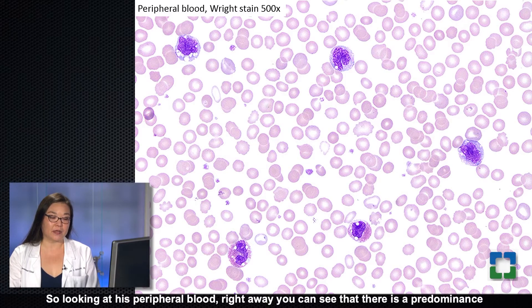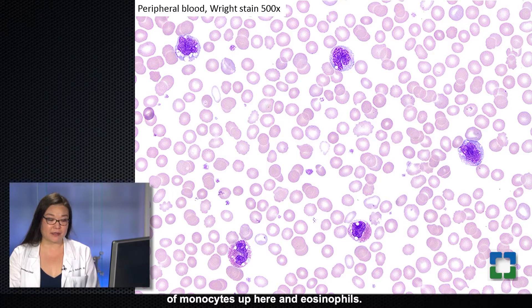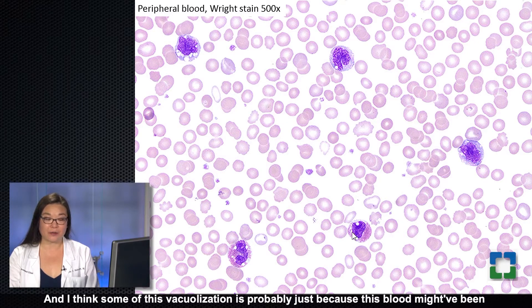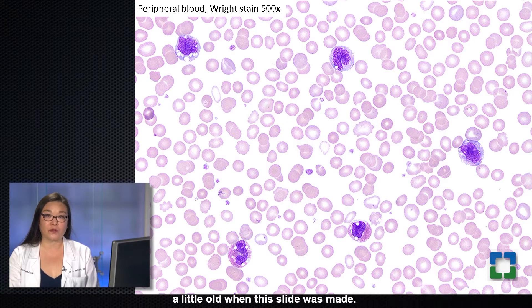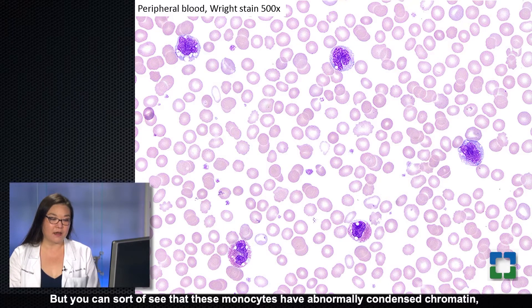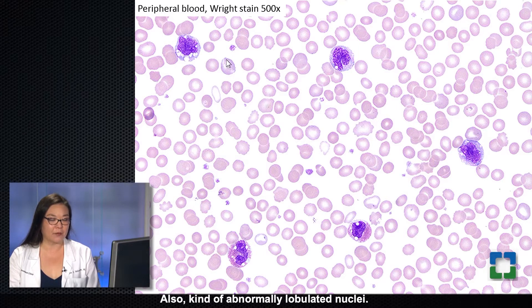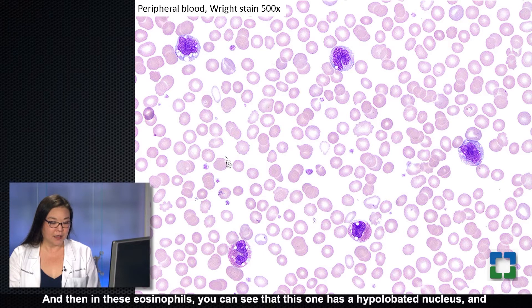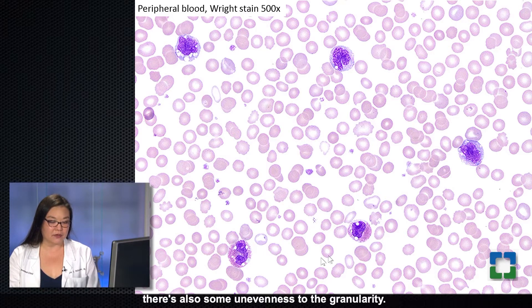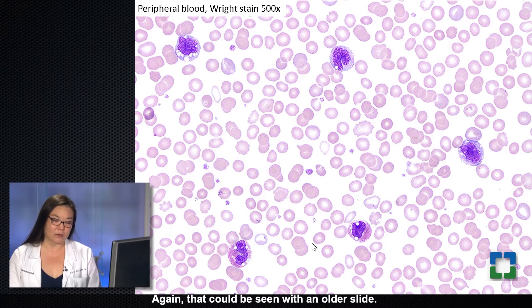Looking at his peripheral blood, right away you can see that there is a predominance of monocytes and eosinophils. Some of this vacuolization is probably because this blood might have been a little old when the slide was made, but you can see that these monocytes have abnormally condensed chromatin, a little bit coarse, and also abnormally lobulated nuclei. In these eosinophils, you can see that this one has a hypolobated nucleus, and there's also some unevenness to the granularity.